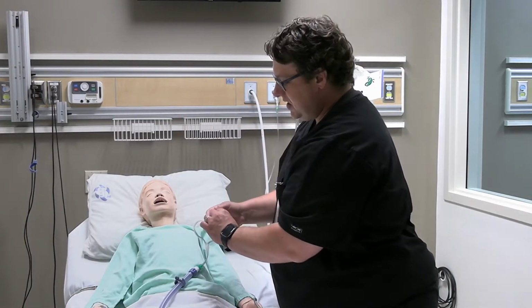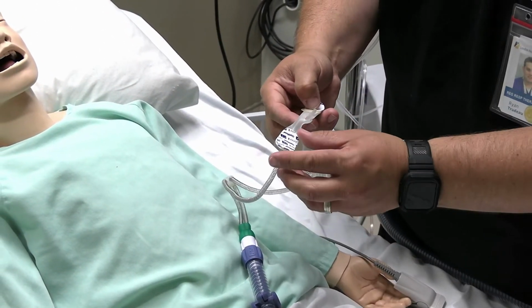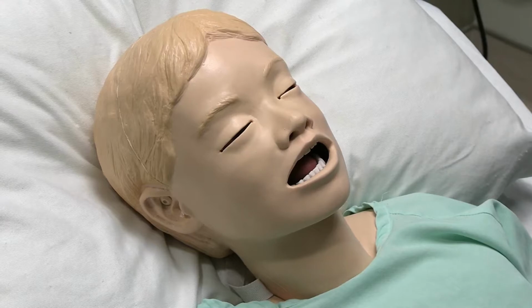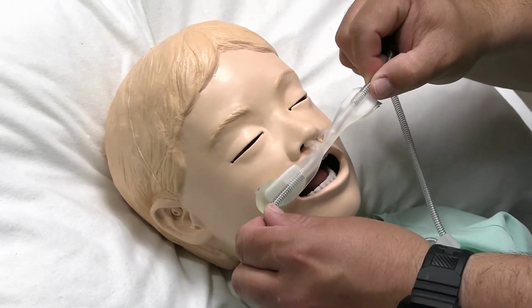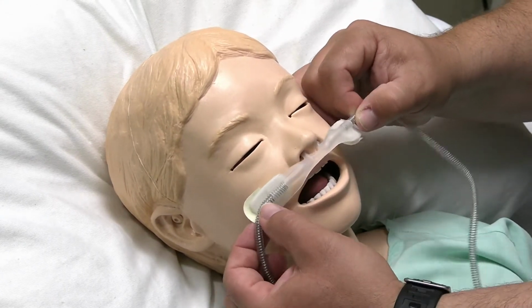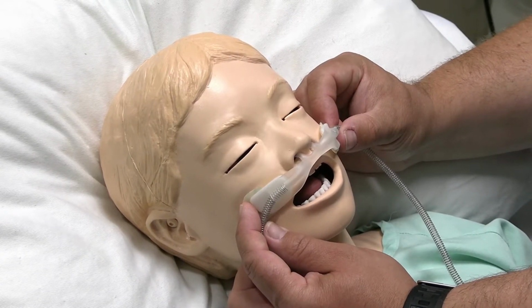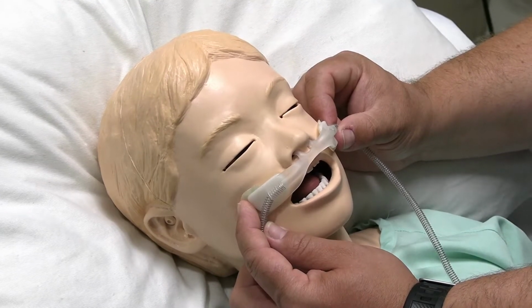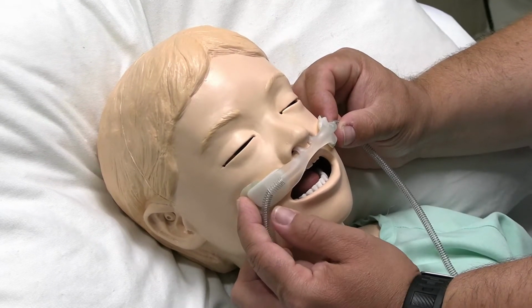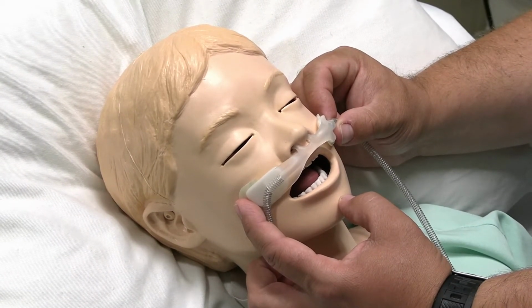Okay. So first thing you want to do is remove the backing from the colloid material for the wiggle pads. So you're just going to remove the first part of the backing. So we're now going to fit the prongs onto our patient. We have pre-sized our patient ahead of time, ensuring that the prongs are not occluding more than 50% of the nares. The material is quite soft and pliable. Make sure that the prongs, as they're going into the nares, don't crush along the septum or anything like that. So just make sure that they're in there nice and smoothly, just like that, and the patient's comfortable.